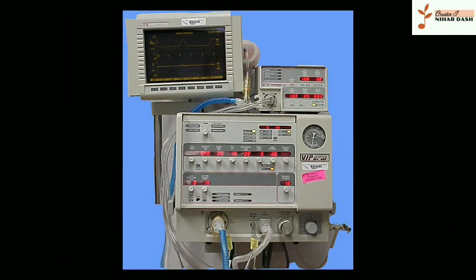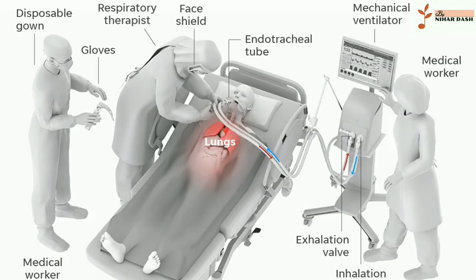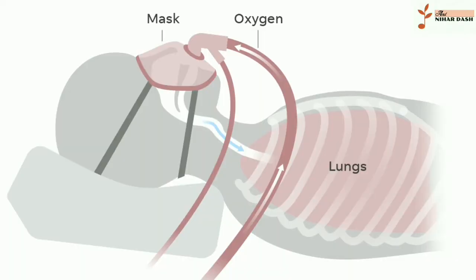A ventilator is a machine that provides mechanical ventilation by moving breathable air into and out of the lungs, to deliver breath to a patient who is physically unable to breathe or breathing insufficiently. Ventilators are computerized microprocessor-controlled machines, but patients can also be ventilated with a simple, hand-operated bag valve mask. Ventilators are chiefly used in intensive care medicine, home care, and emergency medicine as standalone units, and in anesthesiology as a component of an anesthesia machine.